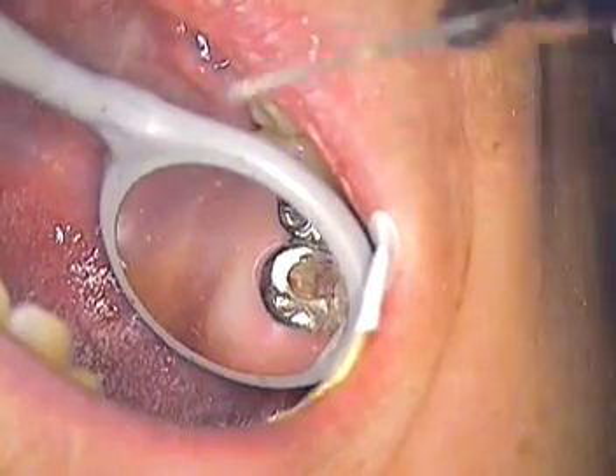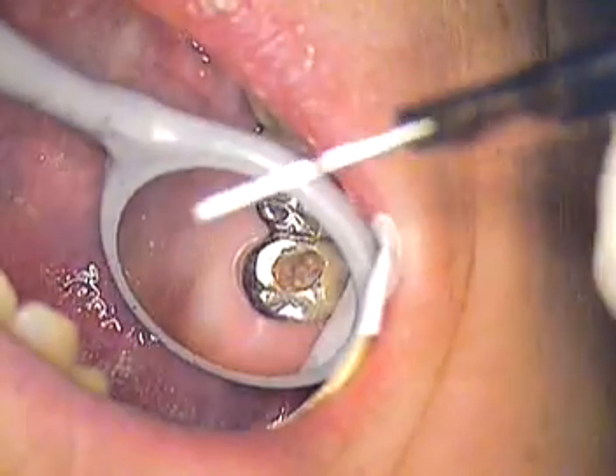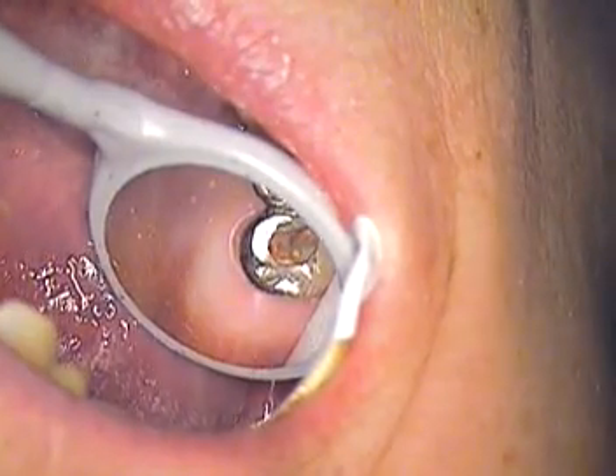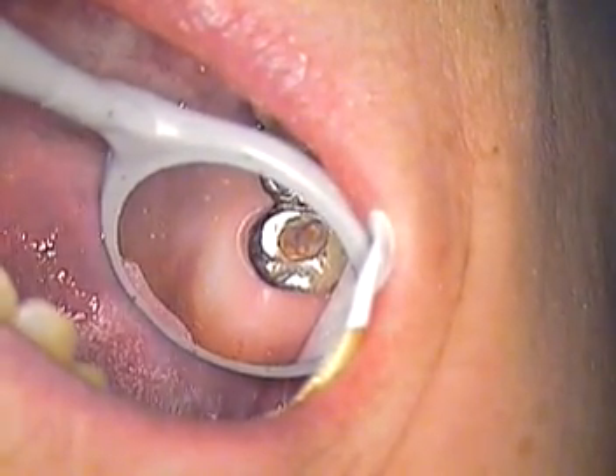We're going to do everything with core paste. We'll cement this in with core paste — core paste will be in there — and put a little bit more on top of it. I'm not going to use any zinc; we're just going to go core paste.